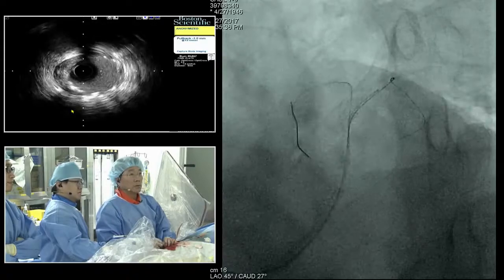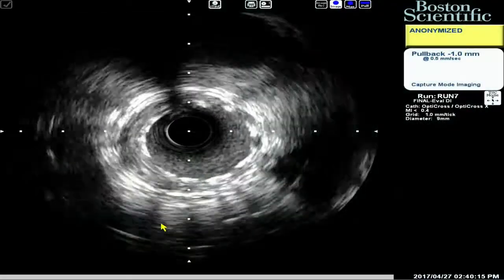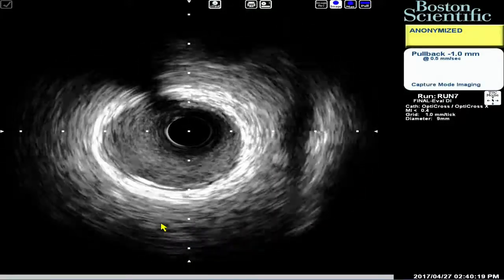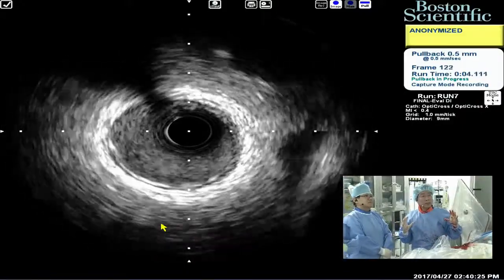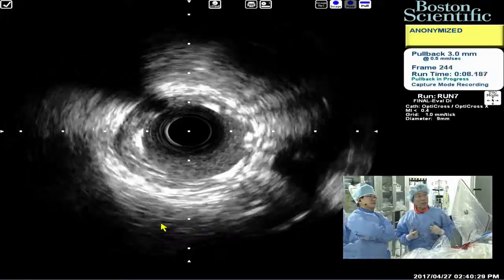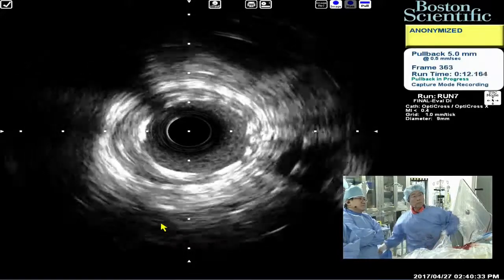So the reason why, okay, this is diagonal. We choose the 2.75. Okay, I want to show the distal part. Okay, here we are. All right, perfect. Almost the 3.0 vessel. We deploy the 2.75. We cannot imagine, so just the angiographic findings. However, it's good. 2.0 something.